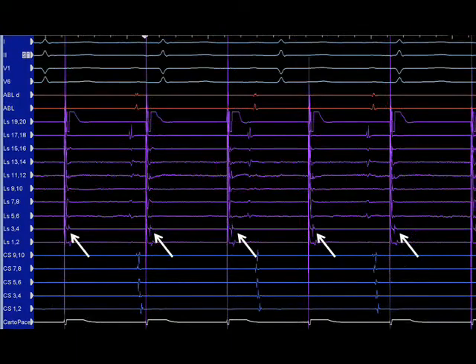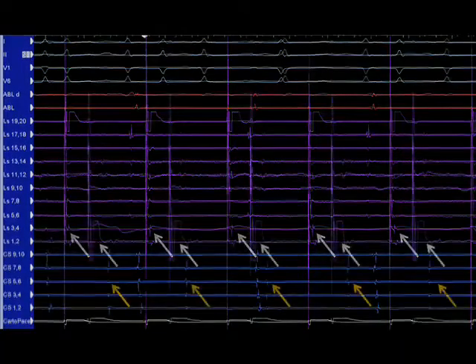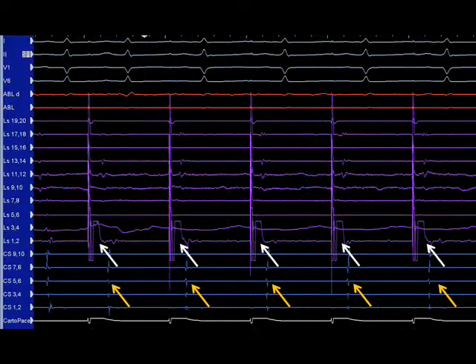Local capture of the pulmonary vein may be seen, with pulmonary vein potentials present on several bipoles following pacing from LS 19 and 20, which does not capture the rest of the heart. This is a sign the vein is isolated. If there is capture from a bipole, where a pacing stimulus advances the rate on the coronary sinus catheter and the surface ECG, the vein is not isolated, and ablation lesions are placed near these bipoles.